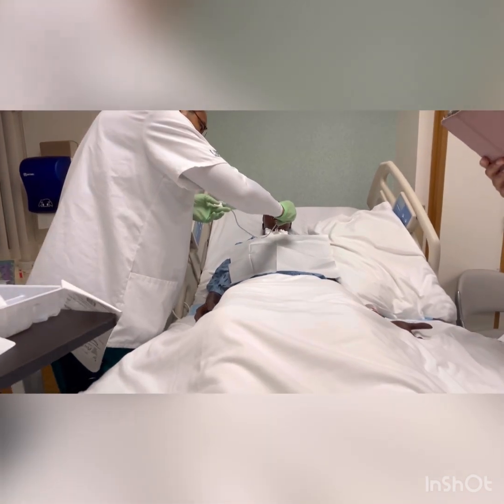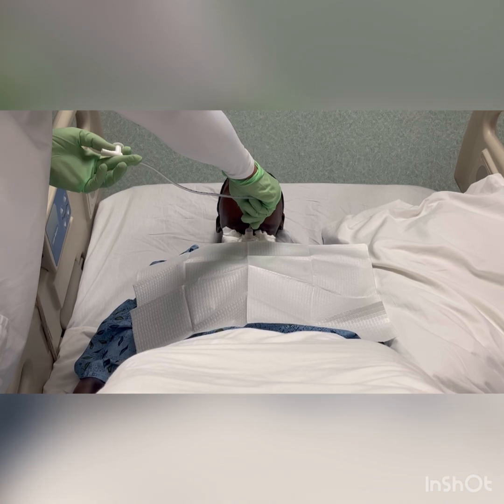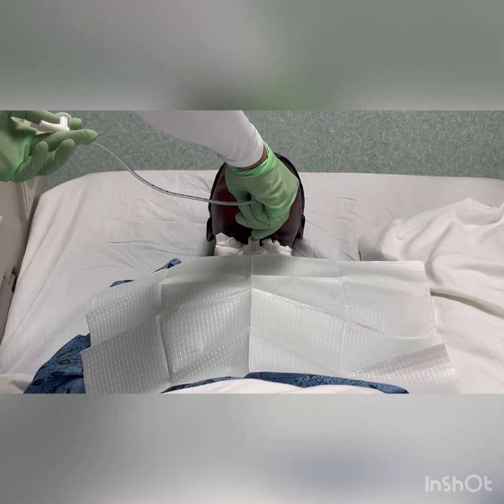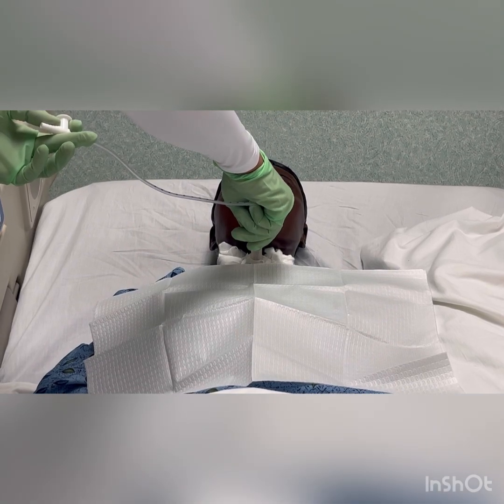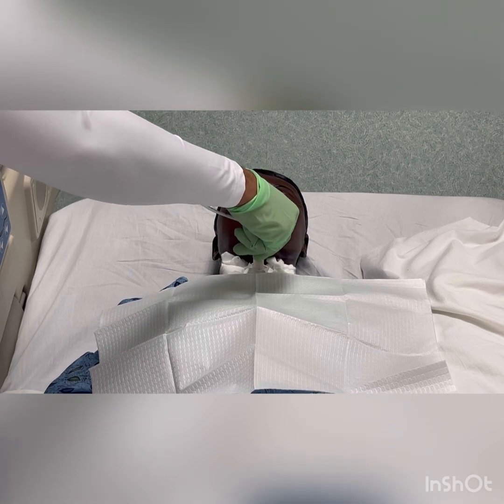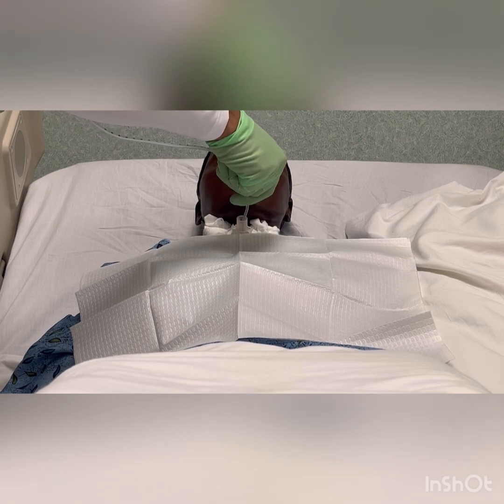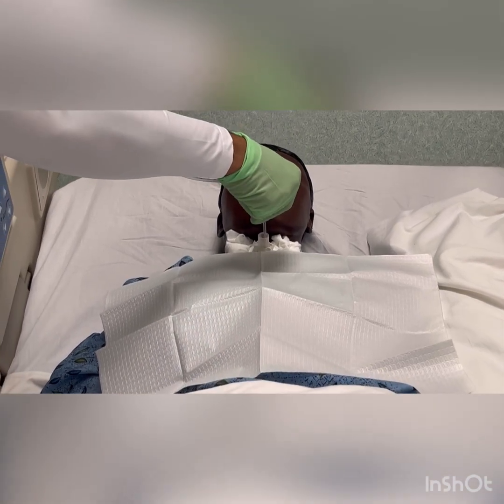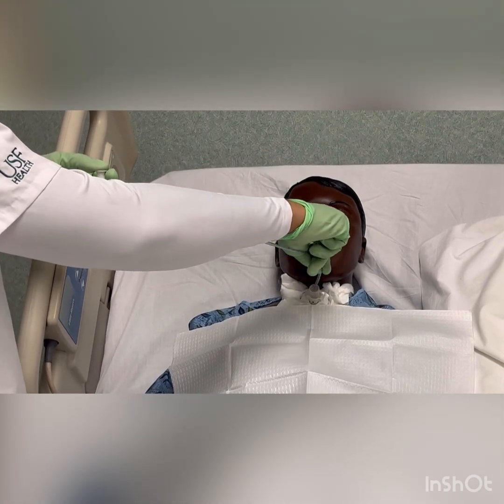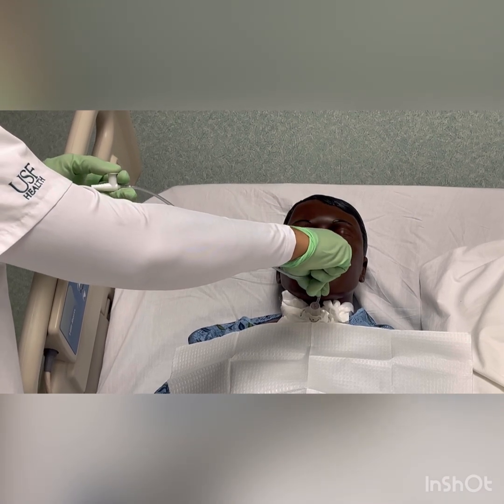Using the dominant hand, gently but quickly insert the suction catheter into the endotracheal tube or tracheostomy tube. Advance the suction catheter with the suction off, gently aiming downward and being careful not to force the catheter. Insert to the pre-measured length, not more than 15 centimeters. Apply the suctioning while withdrawing the catheter and rotating the catheter while withdrawing, and make sure not to apply suctioning for longer than 15 seconds. Repeat the suctioning as needed, allowing at least 30-second intervals between suctioning.